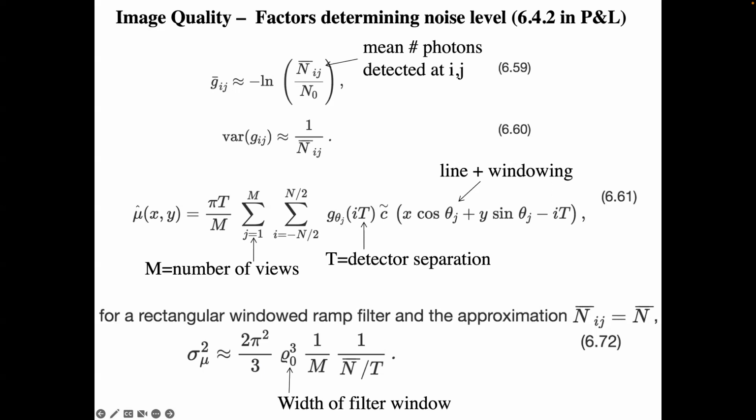I'll get a lower resolution, but a lower variance. So I don't lose anything in terms of signal to noise by averaging those neighbors together. So essentially you can just do that until your signal to noise is a level that is acceptable. Now the resolution goes down as you're doing that.